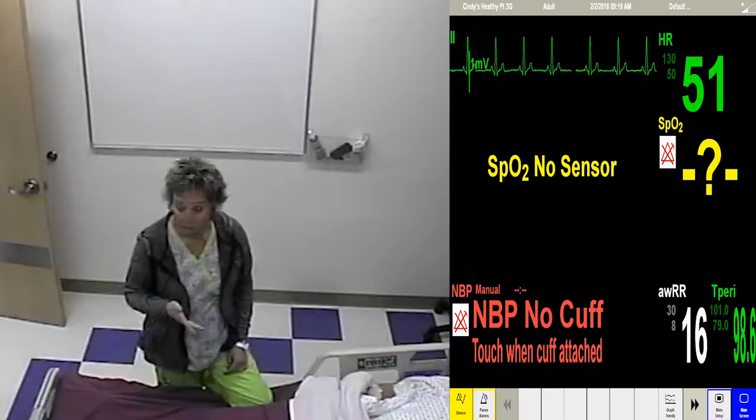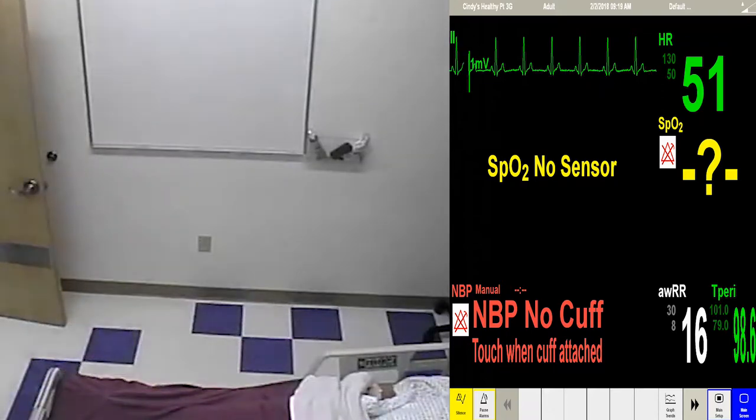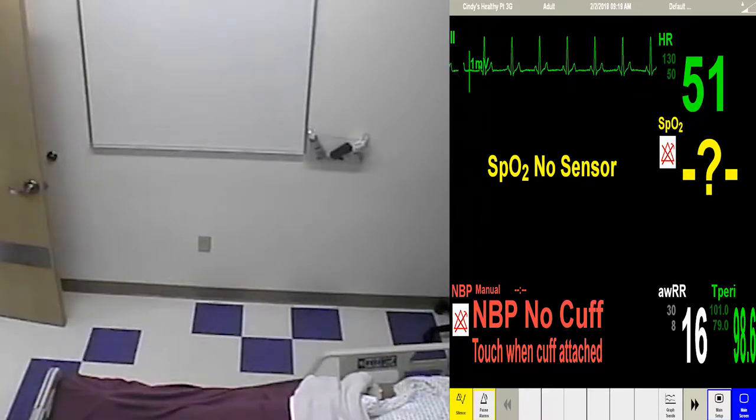So this rhythm is sinus bradycardia. Say it. Sinus bradycardia. Cool people will just say Brady. That patient's Brady.